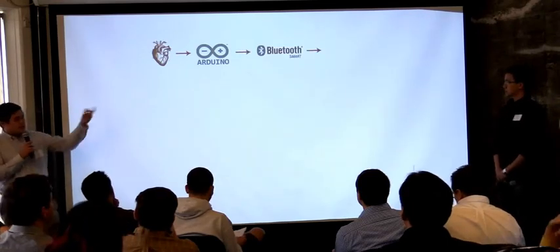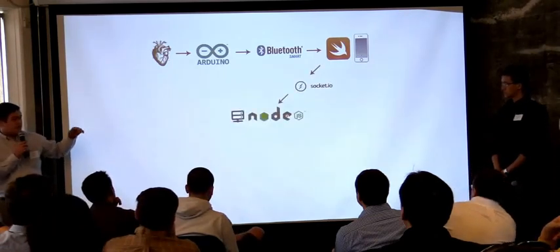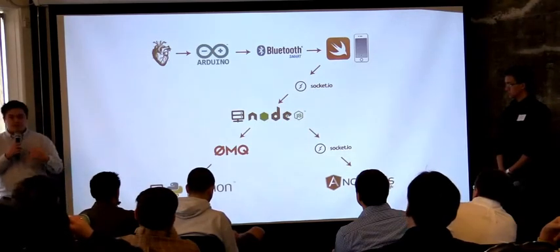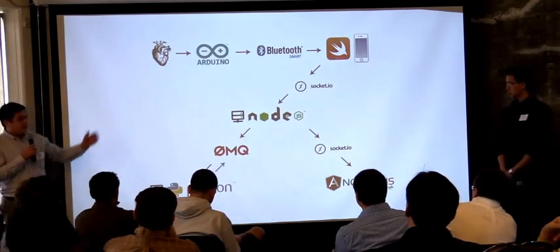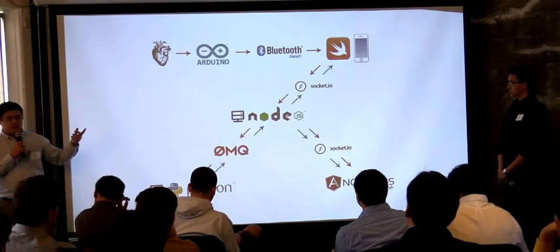The data is then collected in our Swift iOS app, where it's displayed and sent to our Node.js server. From there, it is transmitted to our Python server, where various features of the incoming data are analyzed and then relayed back through the entire system, where the results can be visualized on our web and mobile app.